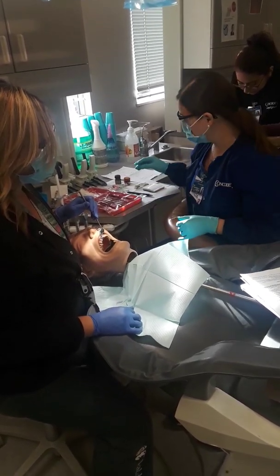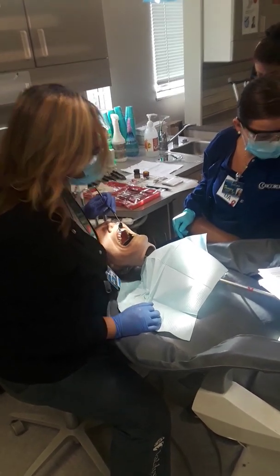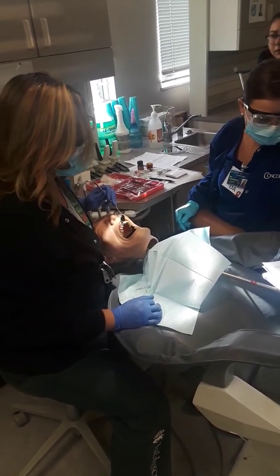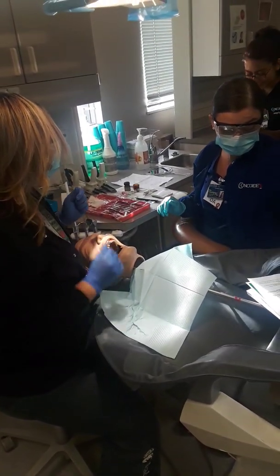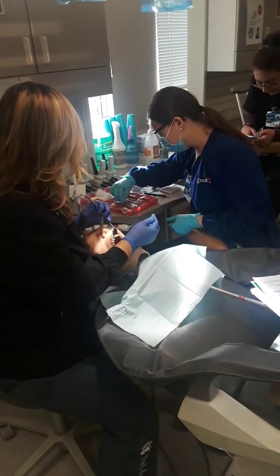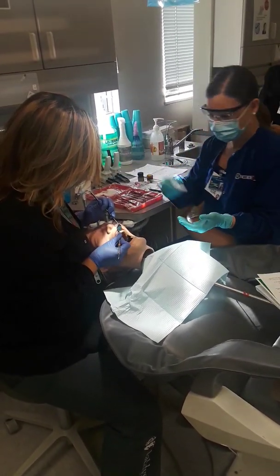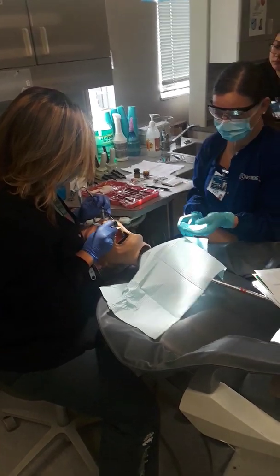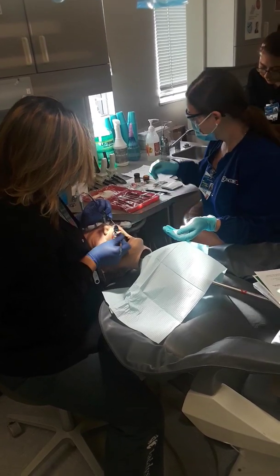Okay, sorry. Looking at, we're on this number 15, 16? Number 12. We're on number 12. We just finished the round burr. Oh, okay, sorry. You're okay. I'm jumping ahead. I was like, okay, did I miss something? Sorry, we forgot to pass the spoon to make sure we have everything we needed to remove. We jumped way ahead.